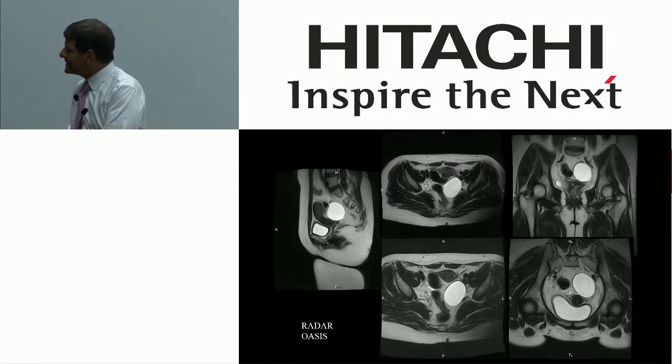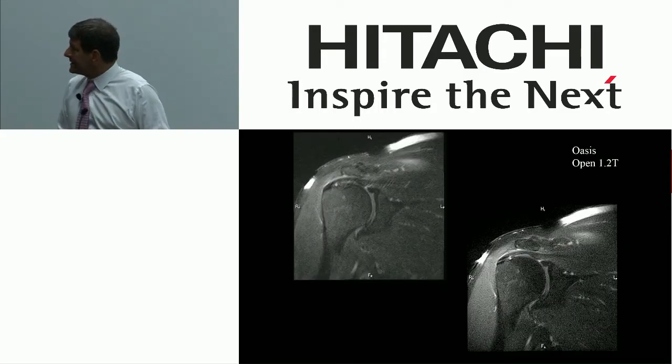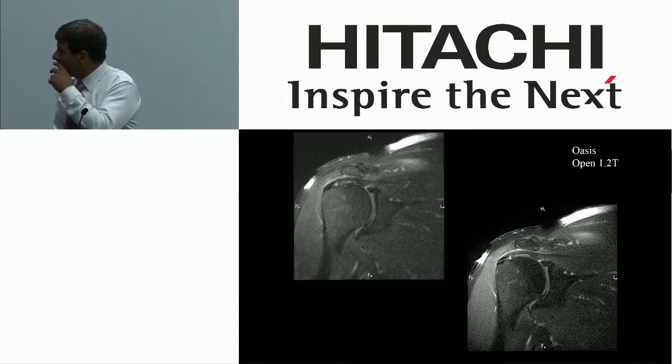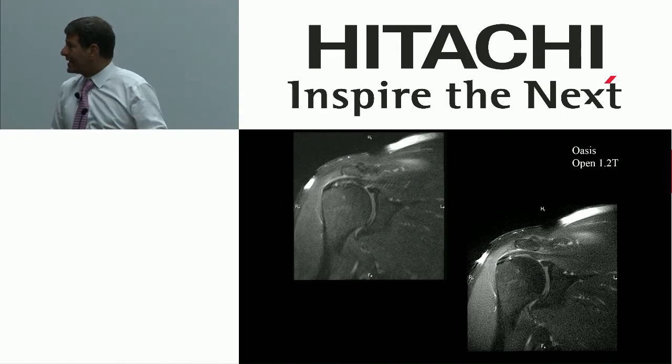It's just the quality is always there. And it just gives us images that are consistent. Here you can see an example of a typical shoulder on the far side up here, with the typical respiratory and somatic motion. And here you see an example done without that motion with the radial acquisition.